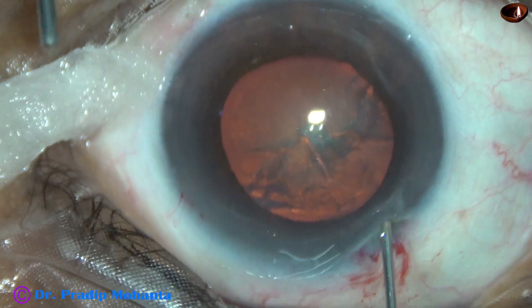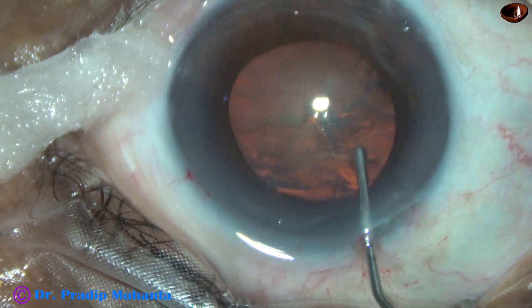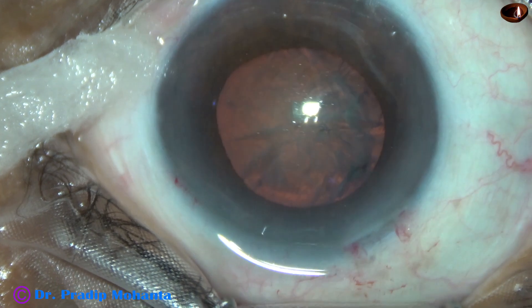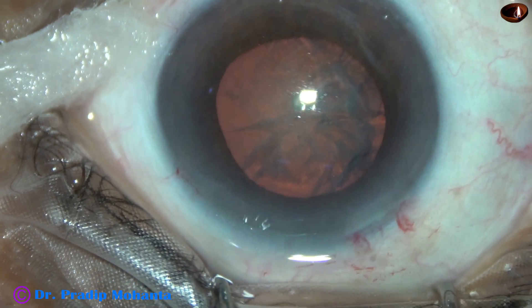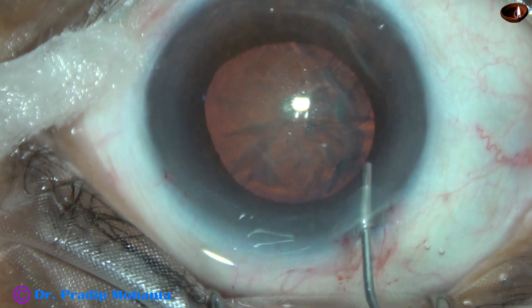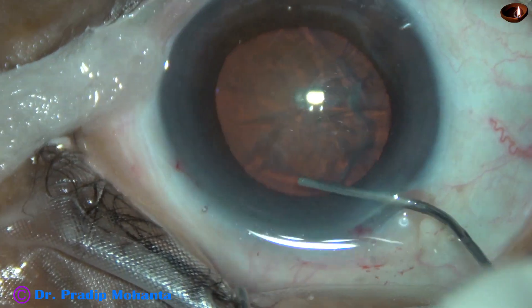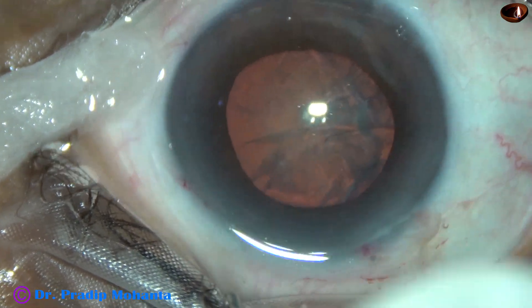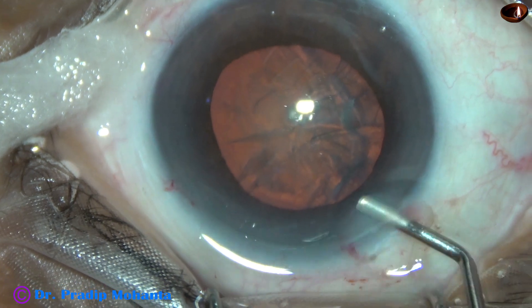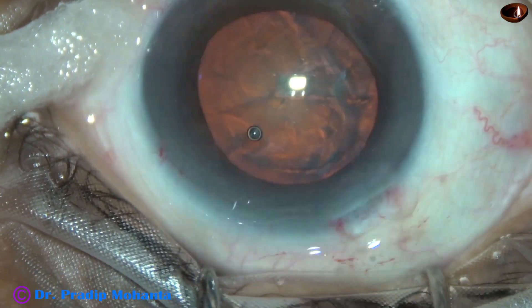This cotton wick will help a lot to keep the ocular surface reasonably in working condition. This is a bit of adrenalin and the pupil has dilated a little more because of the adrenalin.